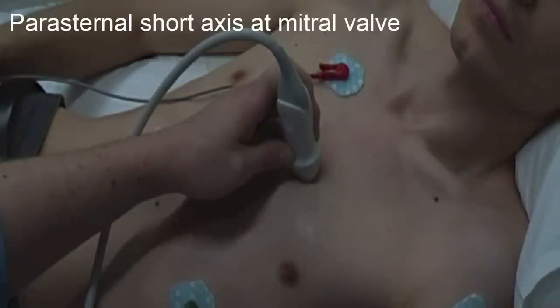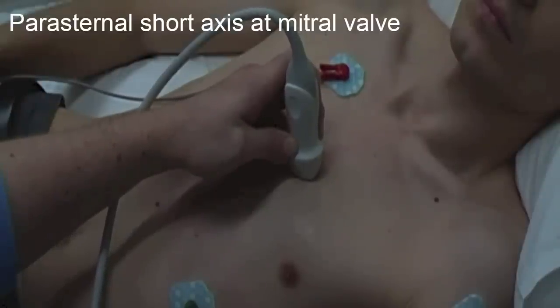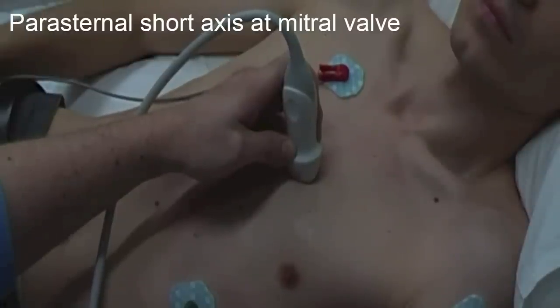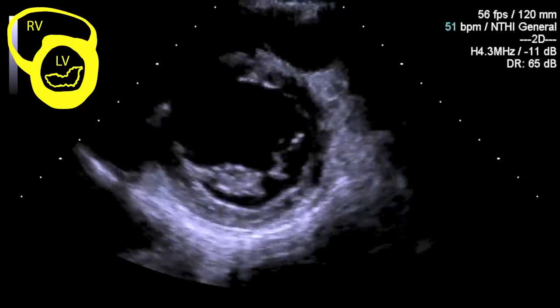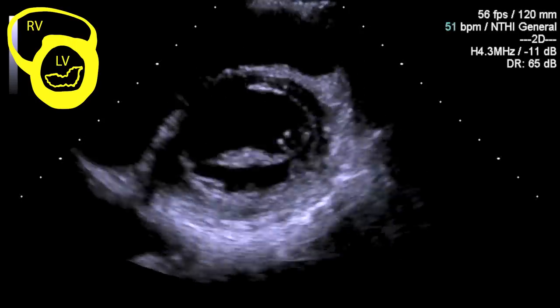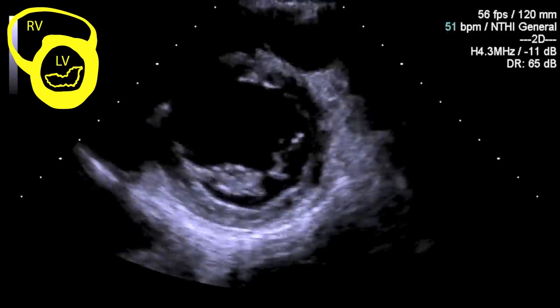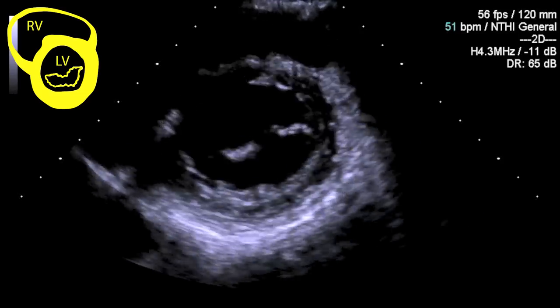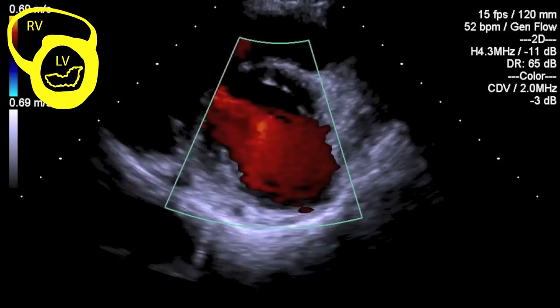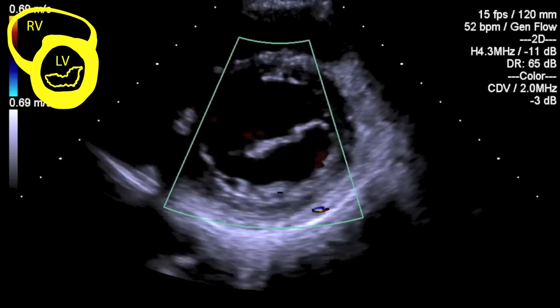The parasternal short axis at the level of the mitral valve is achieved by tilting the probe more inferiorly towards the patient's left hip. Here you'll see the mitral valve on short axis, where you can assess leaflet movements of both the anterior and posterior mitral leaflets. Apply colour flow Doppler to assess for gross valvular regurgitation. Have a look at left ventricular contractility and wall thickness, noting any regional wall motion abnormalities.